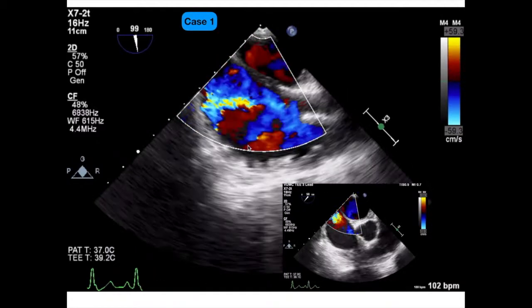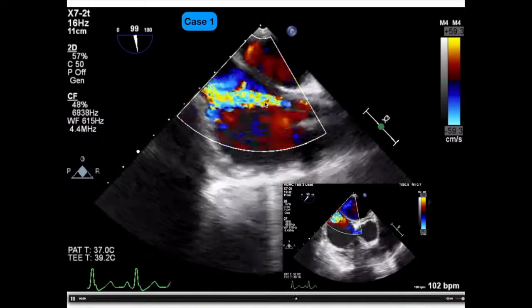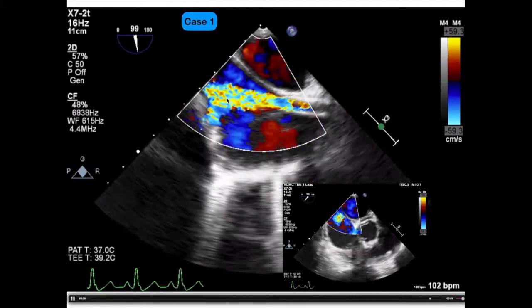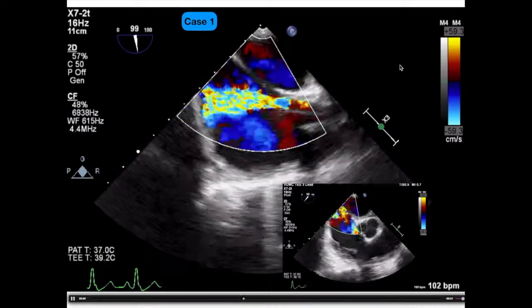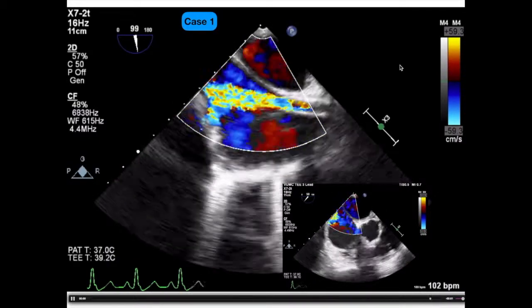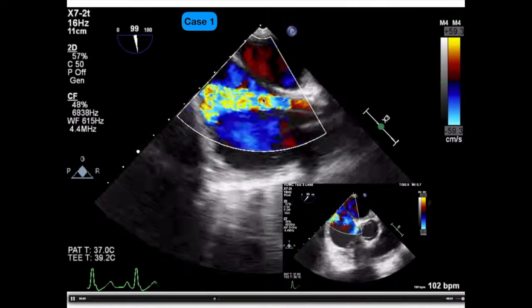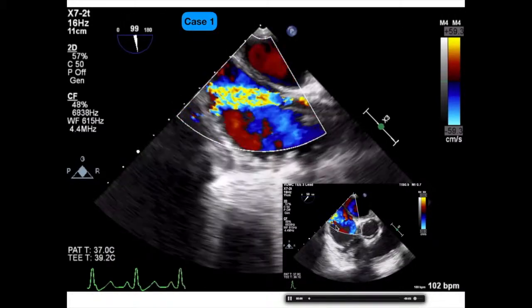So the mystery is solved when we throw a cut vertically through that cannula and we see turbulent flow in the right atrium entering a cannula which is going up to the right IJ and out to an ECMO machine. So the reason this acute pulmonary embolism patient doesn't have a dilated RV is that they're on VVA ECMO. And this is what explains that view that we saw earlier with a turbulent flow in the right atrium.